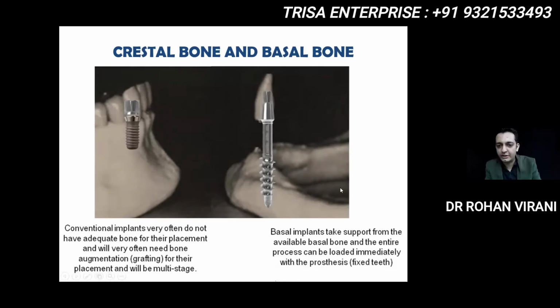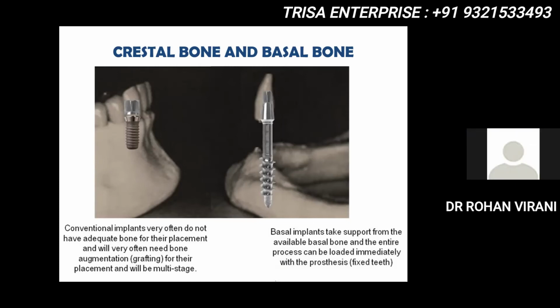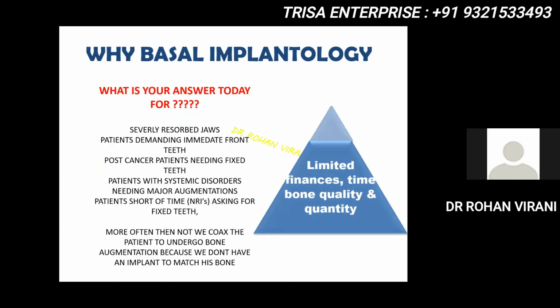So as you see on my screen, for a basal implantologist, we can place the implant in whatever existing bone is there, and we have situations where we can prosthetically correct the position of the implant so that we get a perfect looking tooth wherever we wish to. So this is the beauty of basal implantology.